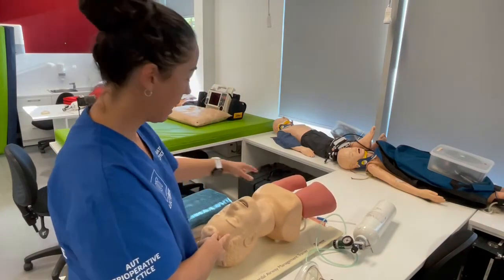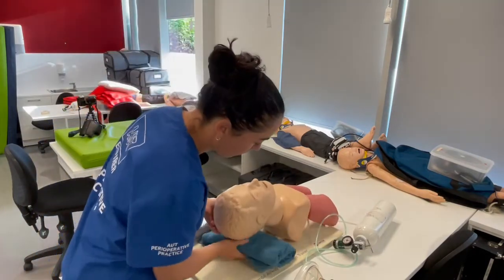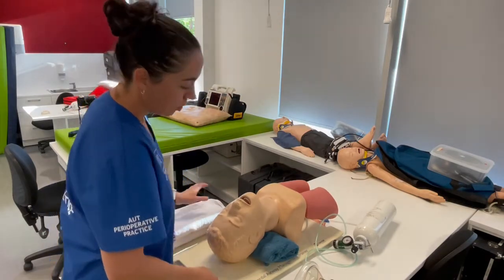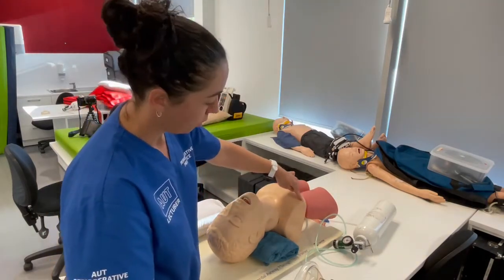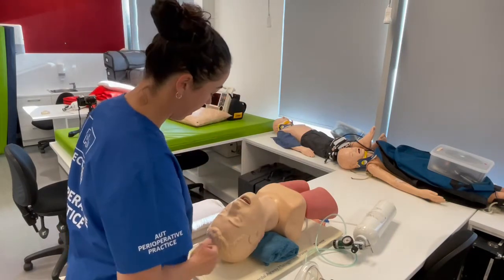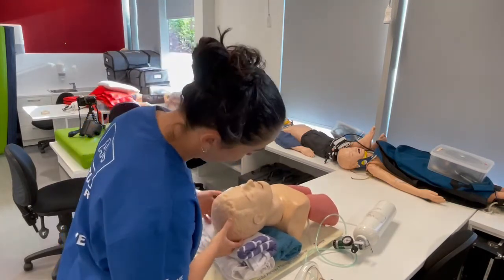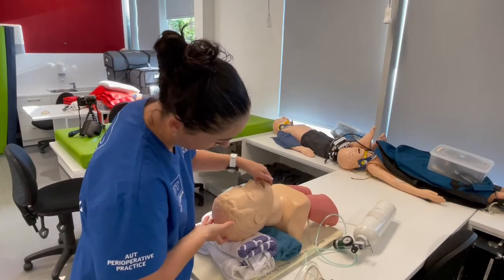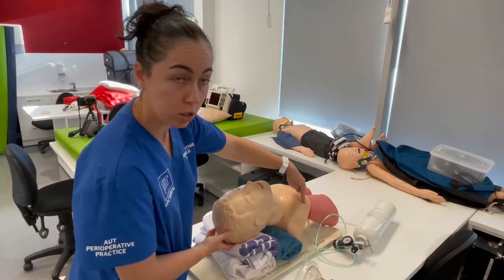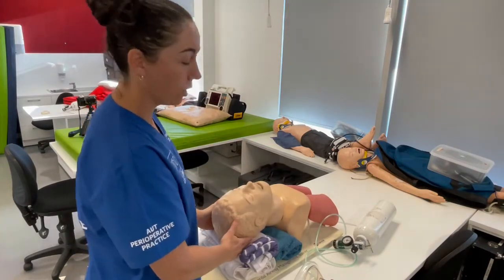We're going to achieve that with padding — towels, pillows, or whatever is available. Pop something underneath the shoulders first, then assess whether you've got your ear in line with your sternal notch. You may also need to add padding under the head to get nice neck flexion, then add head extension to achieve alignment between the ear and the sternal notch.